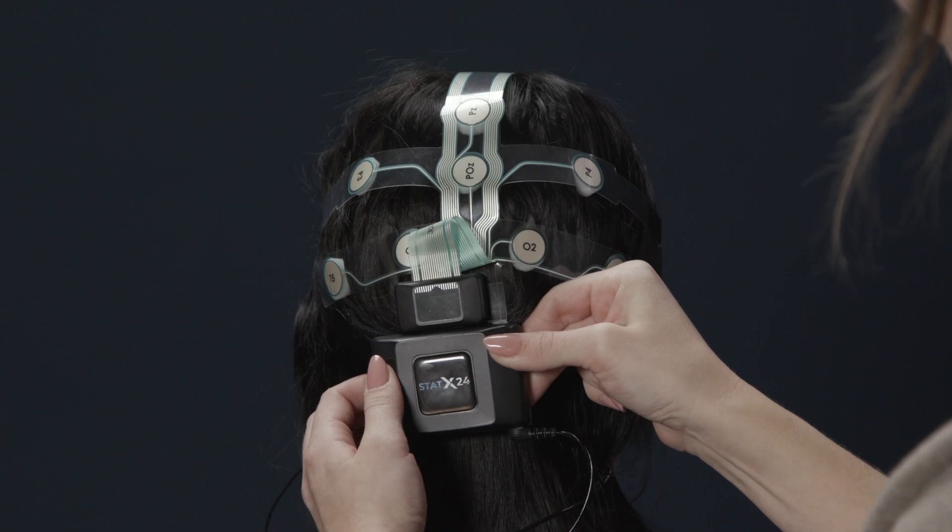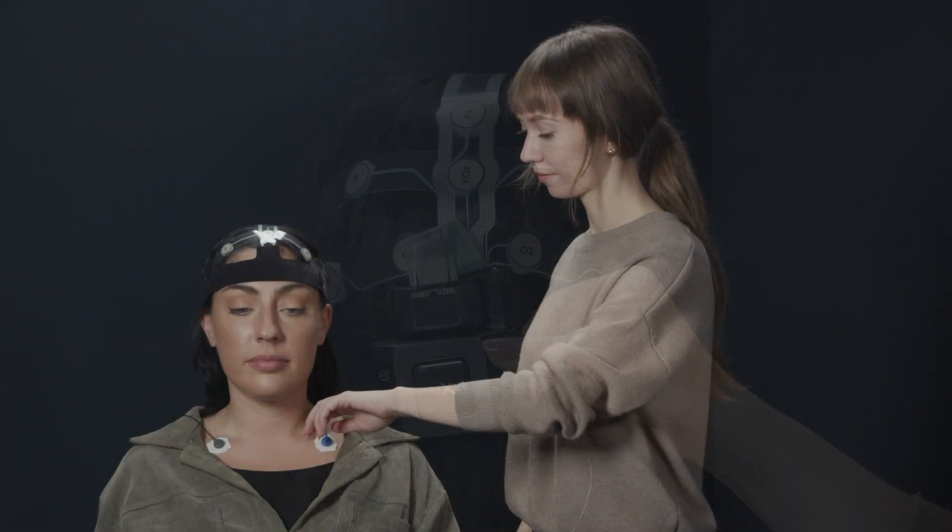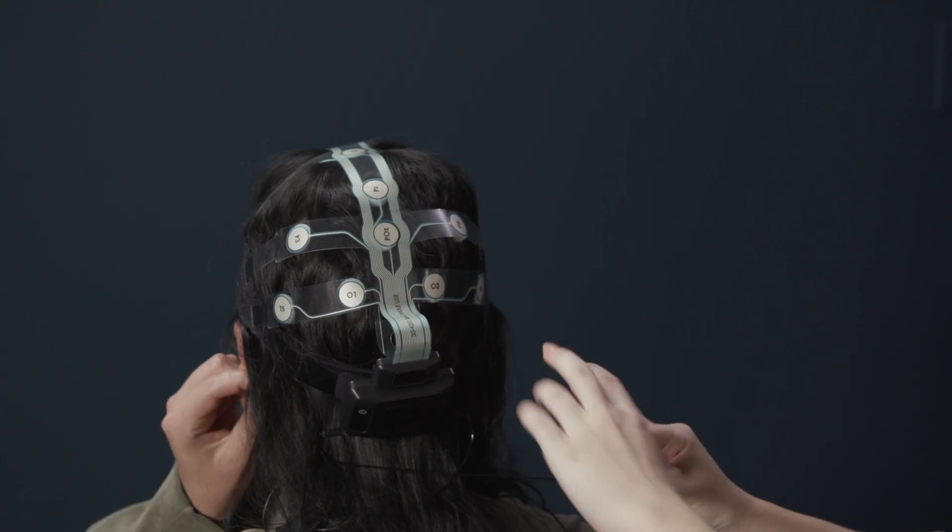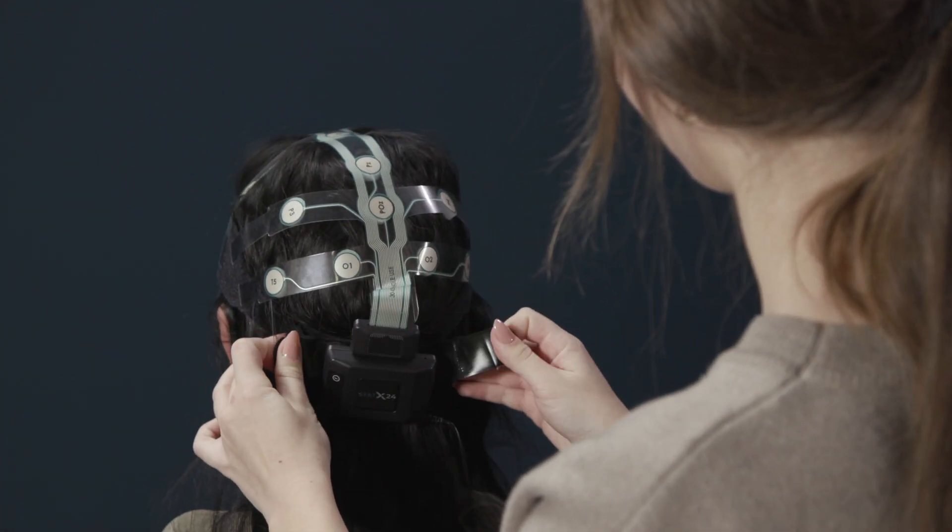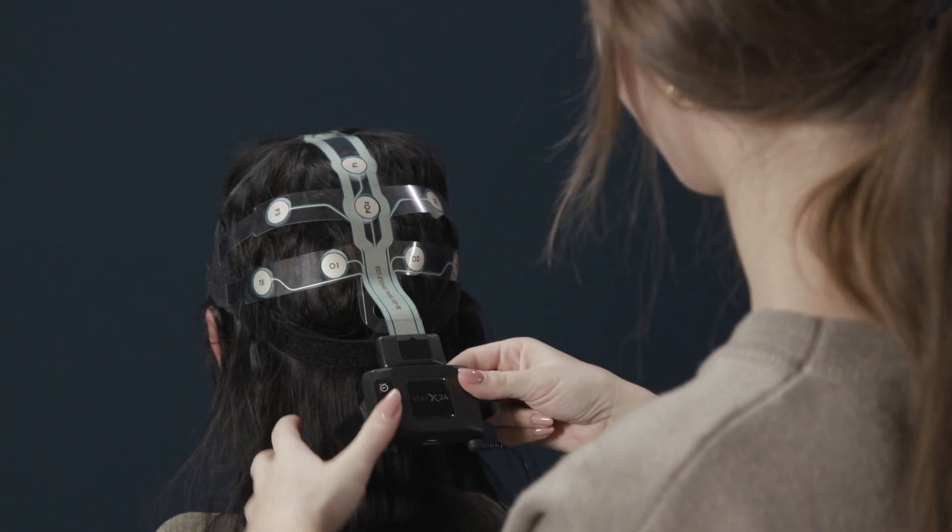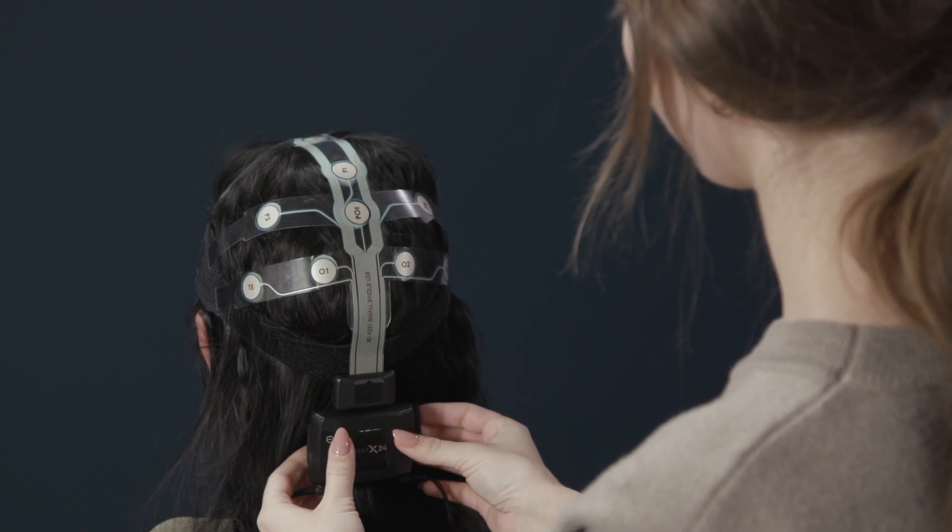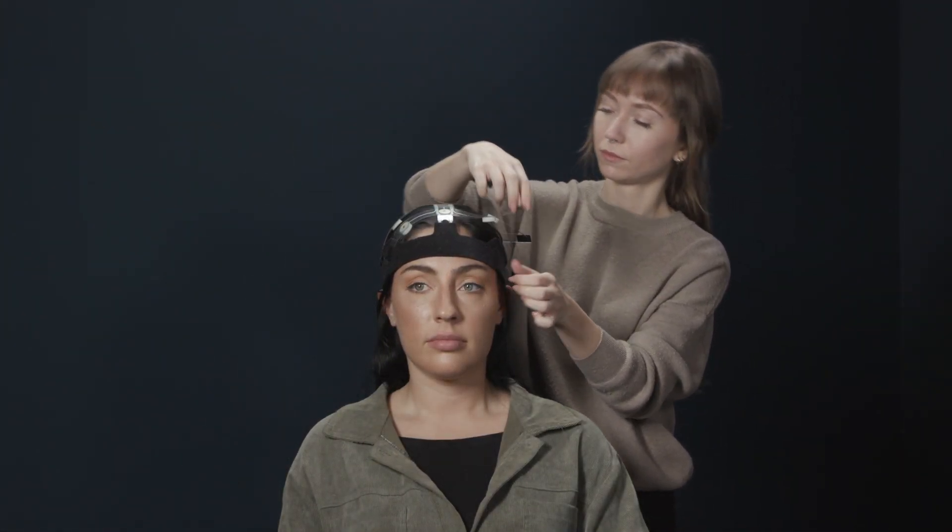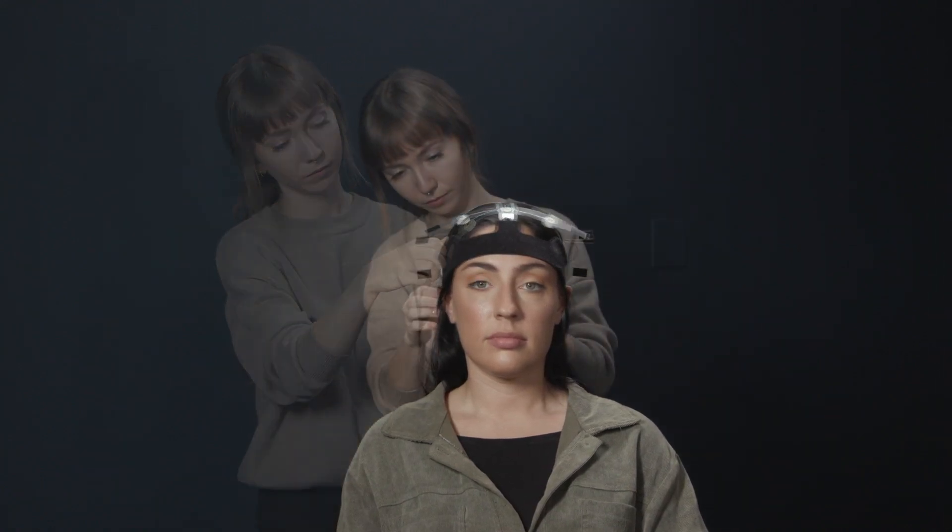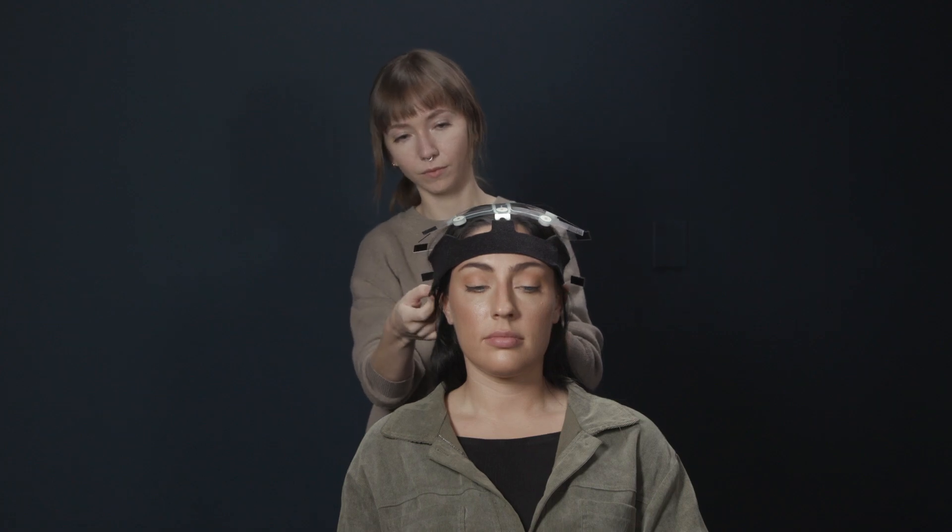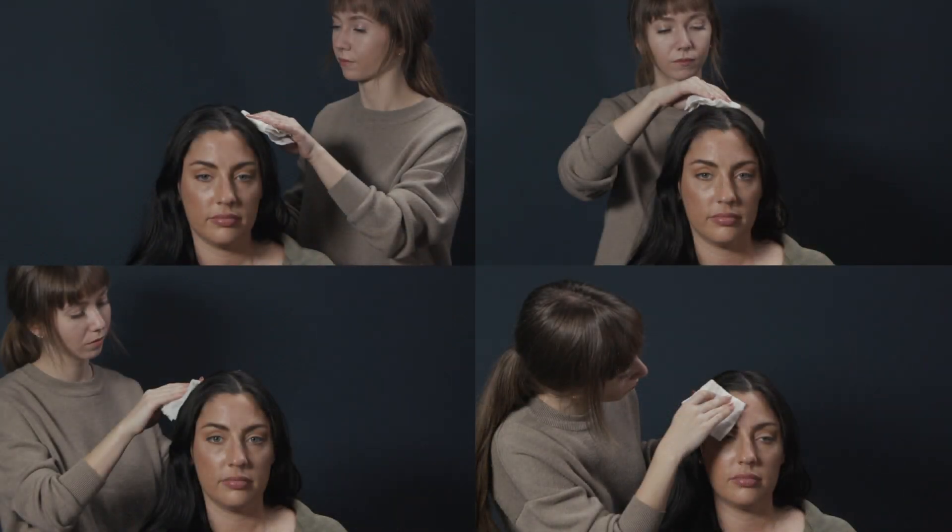When acquisition testing is complete, turn the headset off. Carefully remove the adhesive sensors from the ECG clavicle sites if used, and mastoid sites, or ask subjects to remove them for personal comfort. Unfasten the Velcro tabs that attach the headset to the neoprene head strap, and tuck the tabs in so that they stick to the small strap. Detach all strip arms tabs from the neoprene strap, starting from the back and working to the front. Unfasten the Velcro on the strap and lift the strip away from the subject, being careful not to let the headset or cables hit the participant. Using a damp paper towel, wipe away any residual cream from the subject's head. Do not use alcohol wipes for cleaning up the subject, as it will cause the cream to become stickier and more difficult to remove. Take care not to cause physical distress to the participant.